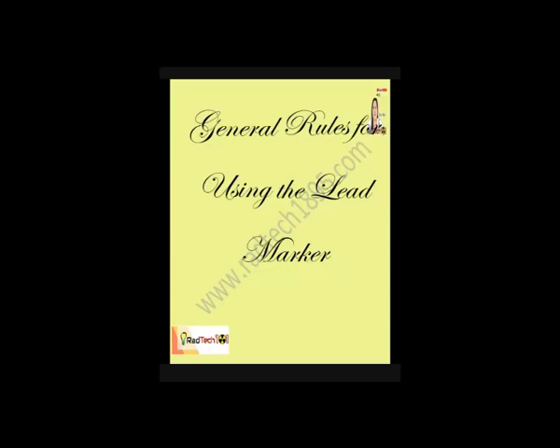Good day, everyone. So, today we are going to discuss the continuation of our topics in radiographic positioning. We will start first with the general rules for using the lead markers. During radiographic examination, especially in conventional radiography, we are using cassettes, and cassettes have lead markers. Also, during specific or particular examinations, we are required to use additional lead markers for various purposes.